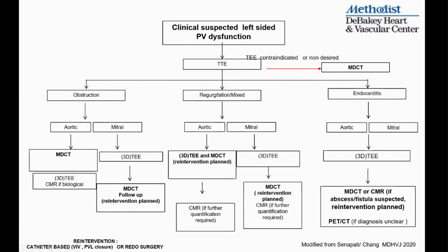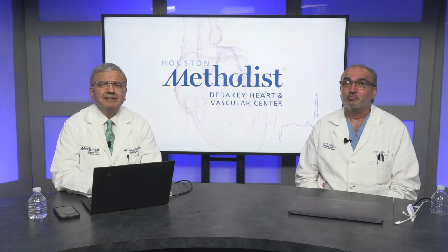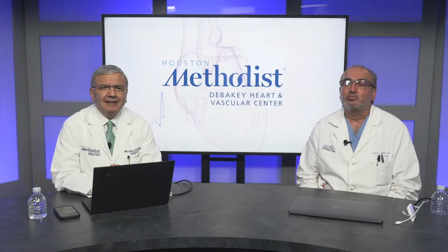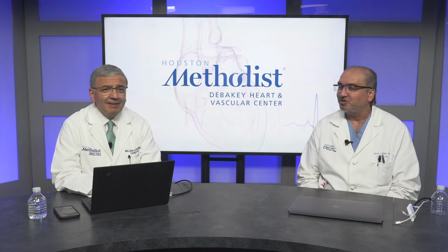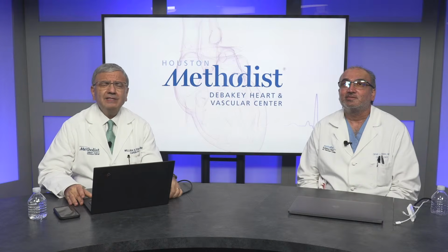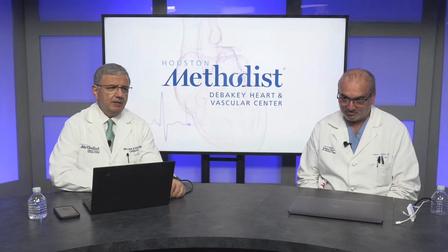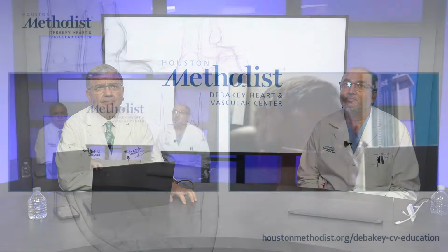Very good. Thank you, Sumin, really for a great overview of what CT can offer. And I think we've covered echo, MRI, and CT, right? Yeah. Maybe I have a question for you, Dr. Chang. Sure. What can we know from CT if we do not do angiography?